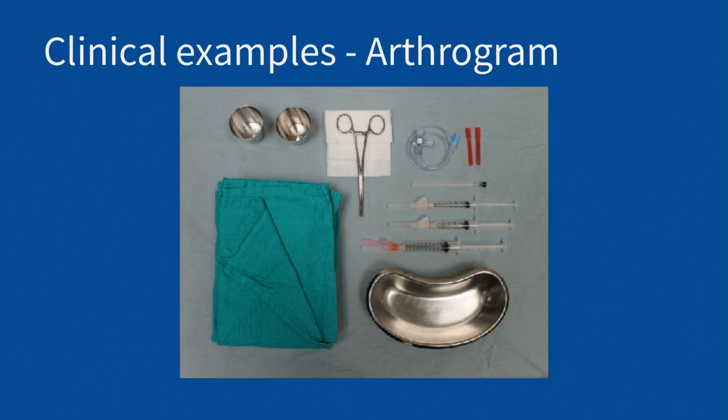Just as a little detour, the patients where MRI typically does not work are patients with a pacemaker being the most common. There are some aneurysm clips. There are some coronary stents that may preclude the patient from having an MRI. If the patient ever worked with any metal and actually has metal in the eye, we typically do not do an MRI unless it's critical.